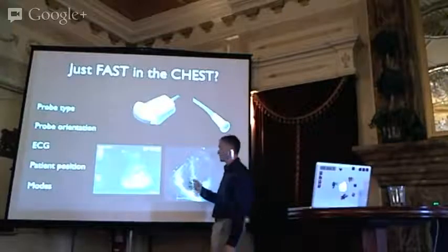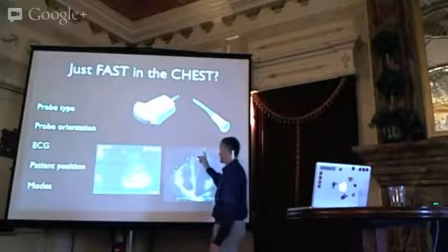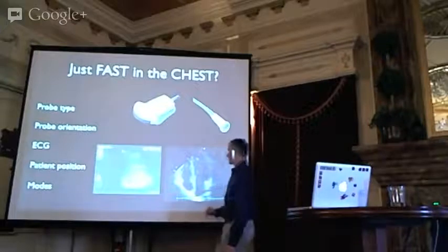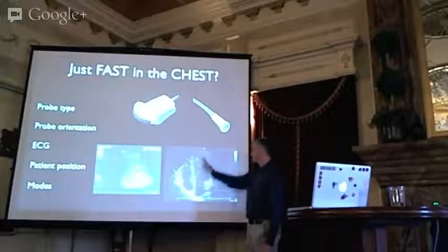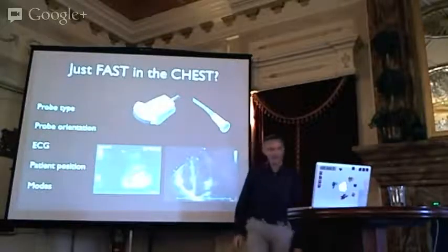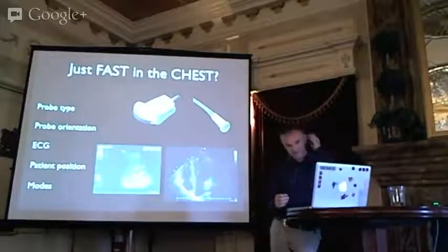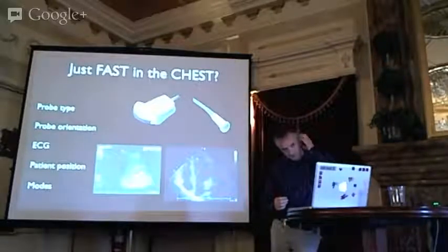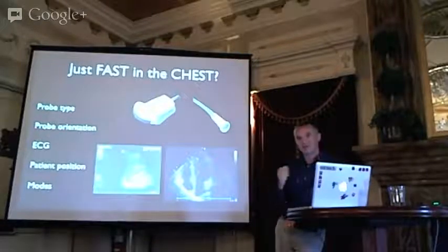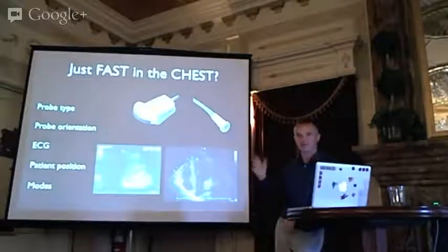the probe marker on the actual transducer will always correspond to the marker on the screen. But when we're doing an abdominal scan, that's on the left side of the screen. When we put the echo settings on the machine, that flips to the right-hand side of the screen. But it will still correspond to the probe marker, and you don't have to worry about that. You just have to do the echo in a certain way. I'll talk through and we'll practice it in the demonstrations, holding the probe in a certain way and sticking to the same sequence every time so we never get confused about which way around it is.